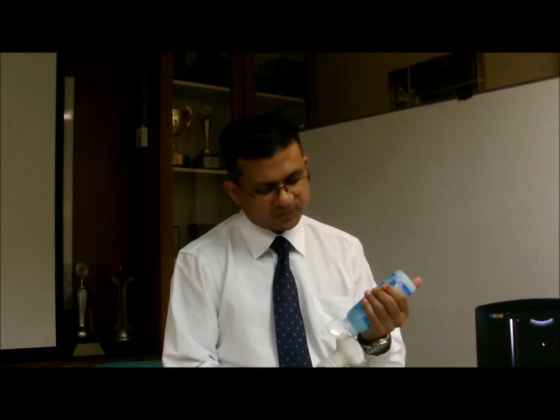Or a patient may come in with constipation, very bad abdominal pain, and a distended abdomen. You're thinking of bowel obstruction, and you could take a look at whether there's any bowel obstruction by looking at the small bowel and the large bowel. Or sometimes you're thinking of a perforated gastric ulcer. You could also take a look whether there's any gas. And a patient may come in with right hypochondrial pain or with jaundice and you're thinking of hepatic abscess or cholelithiasis or cholecystitis. You could take a look straight away at the liver or the gallbladder. So let's just go through all those possibilities.